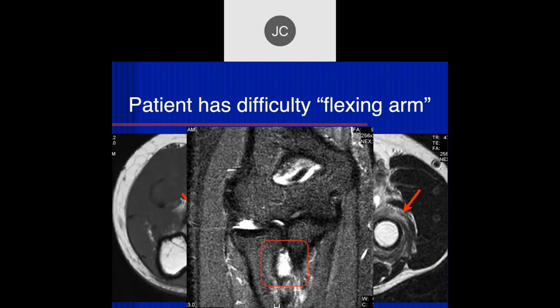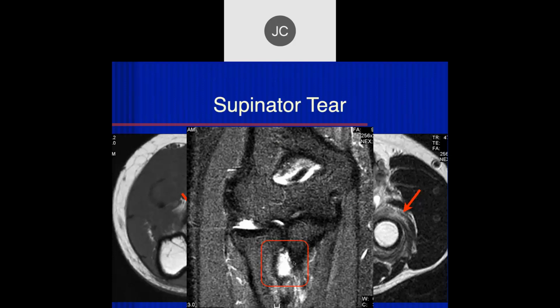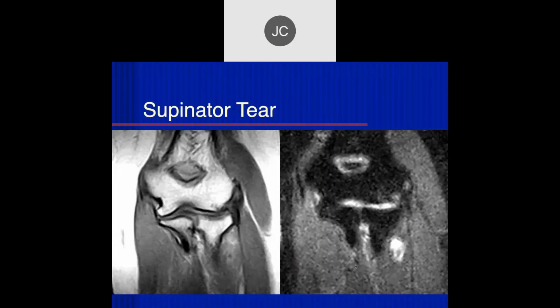Yeah, this is maybe traction edema. So which muscle goes around the radius at this location? This is the supinator. So this is a tear of the supinator muscle. And here's another example of a supinator muscle tear, here and here.